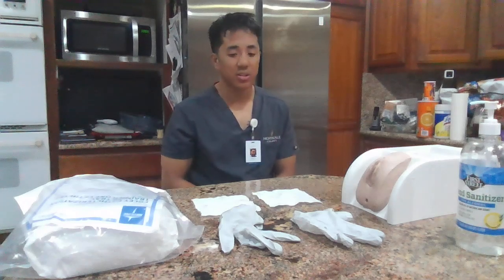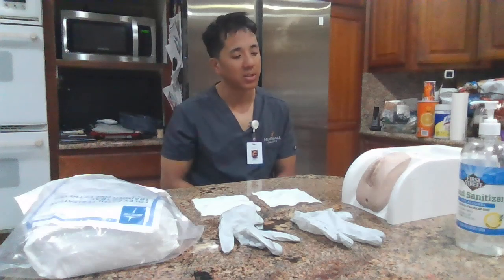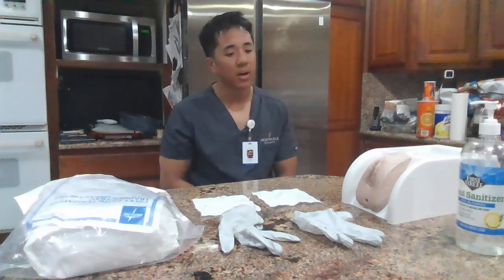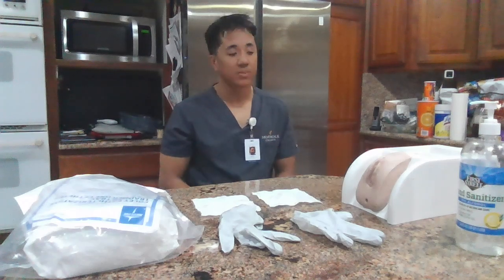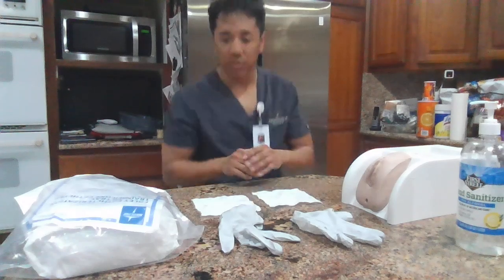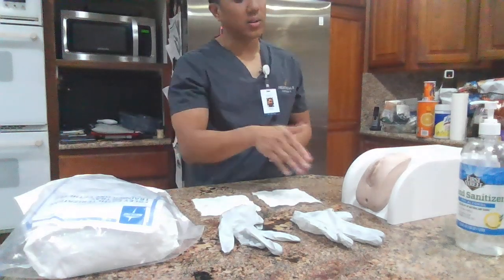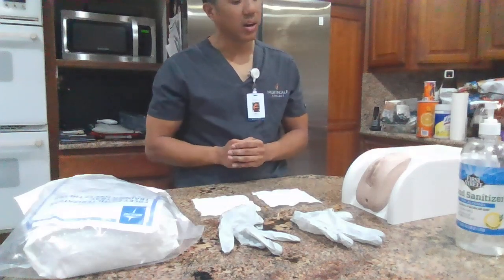Today the doctor has put in an order for placement of a Foley catheter, which is a tube that's going to sit inside your bladder and continuously drain your urine. Is it okay if I place that on you today? Okay, so I got the consent from the patient. All right, Mrs. Smith, first, before we do anything, I'm going to clean your area, and then I'm going to walk you through the whole Foley catheter insertion process.